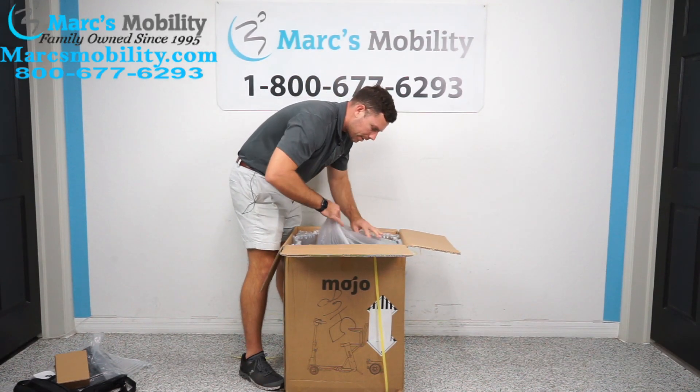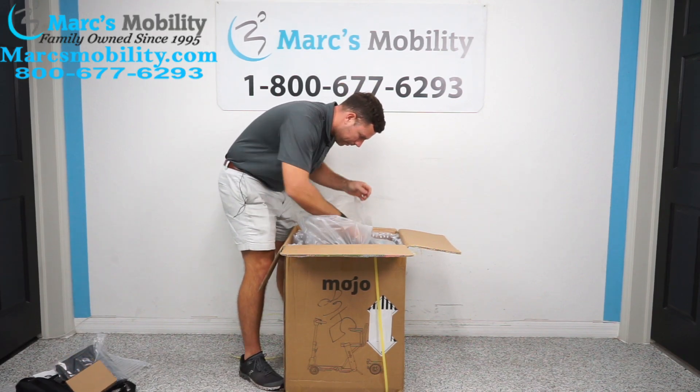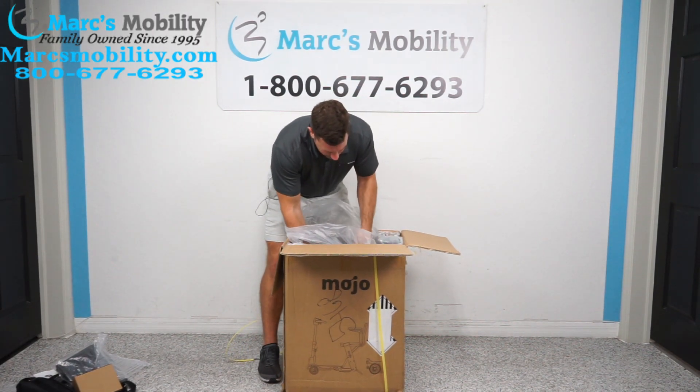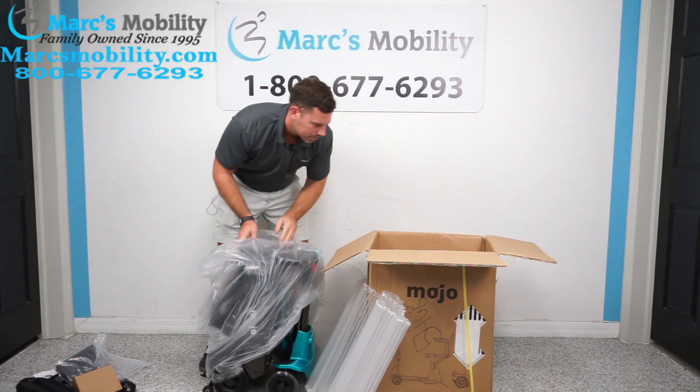Most of these units, they ship with a little plastic covering over them, but they are pretty much fully assembled. With this unit, it weighs about 60 pounds.